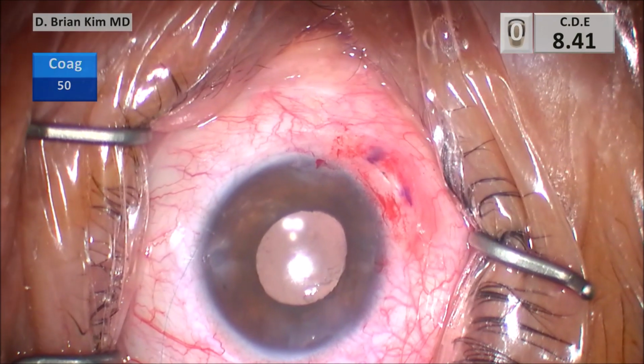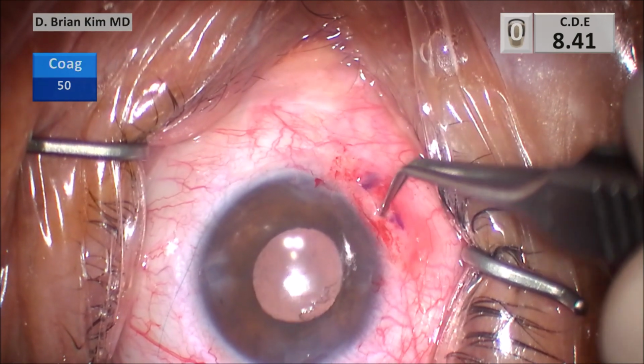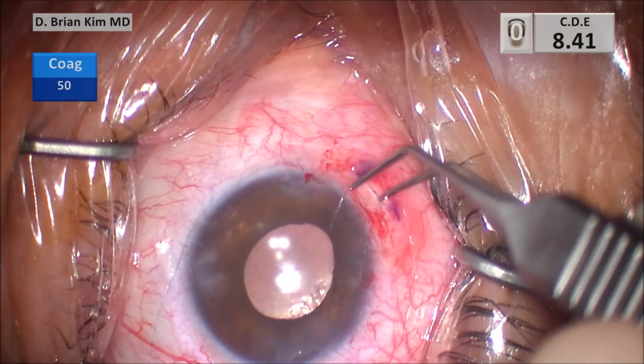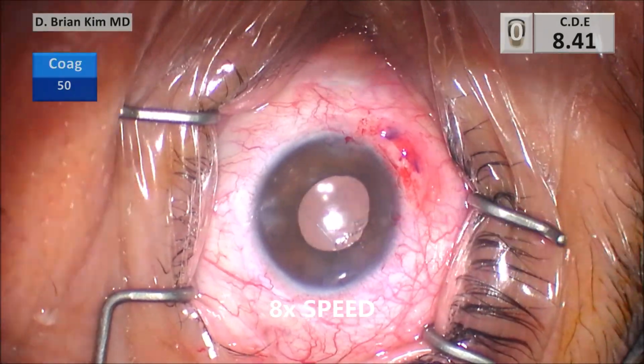And then here I'm going to turn that knot towards the sclerotomy area and just push that knot down into the sclerotomy, and then place an Ethibond suture to close the scleral groove in that area, and then use that same Ethibond to close the conjunctiva.